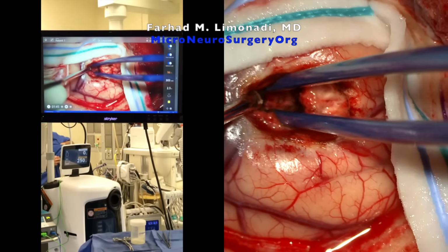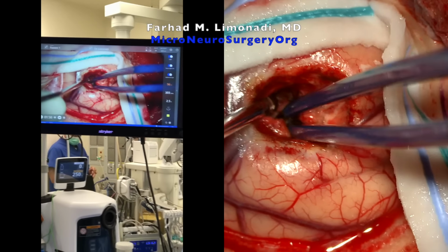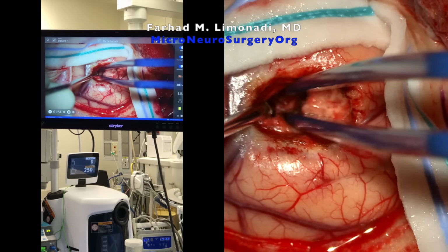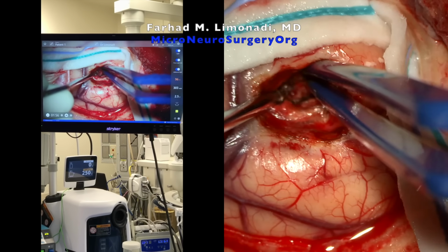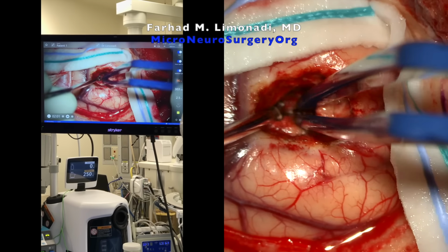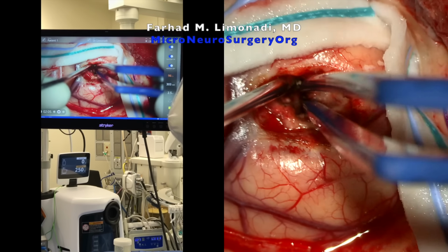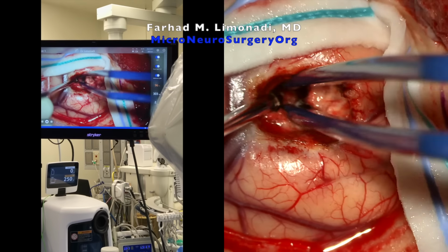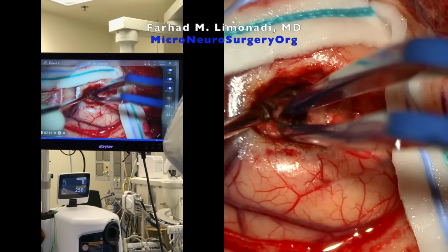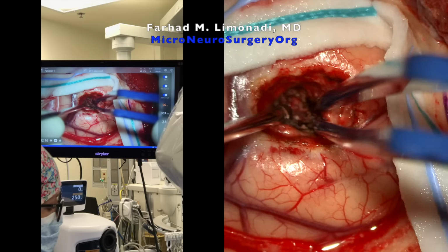That way, we have the advantage of both maintaining the capsule and at the same time decompressing the tumor, so that we can fold the capsule in the cavity and pull it out without any damage to the frontal lobe, which is so sacred and critical to preserve. That's what we are doing: very careful bipolaring inside the tumor. We are taking the tumor inside out first, and then we are going to fold the capsule within this cavity. That way we minimize any damage to the frontal lobe.